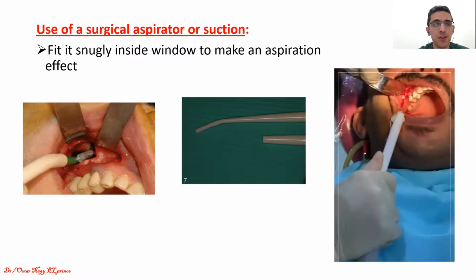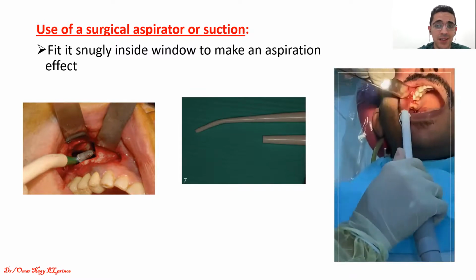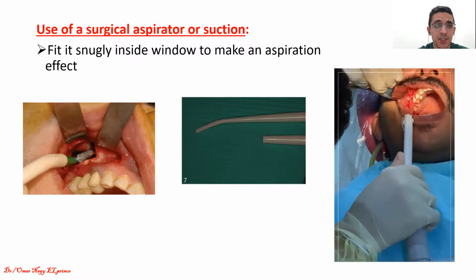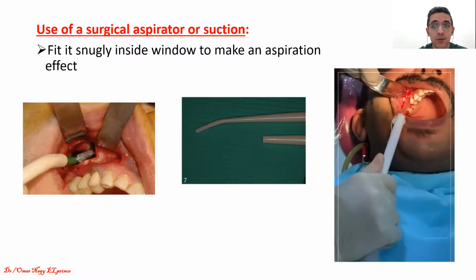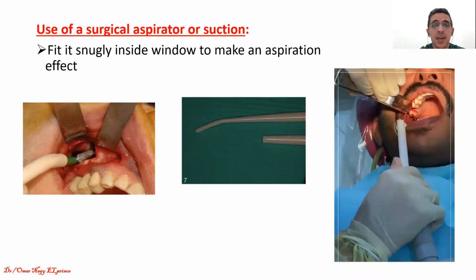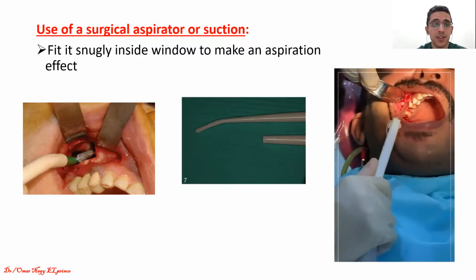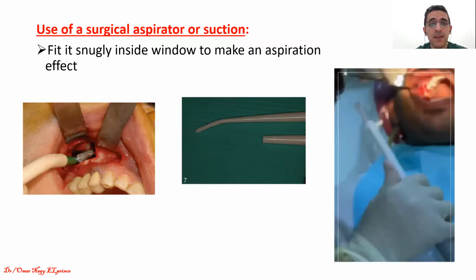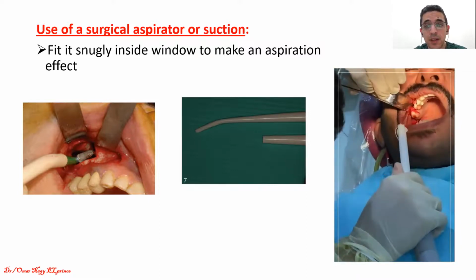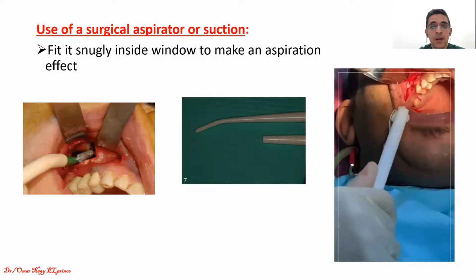And this has been documented in much of the literature. As I have discussed previously, my students and I have conducted research about this, a systematic review. The systematic review found that most of the literature mentioned using a surgical aspirator during retrieval from the maxillary sinus.